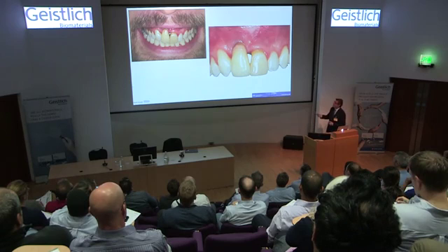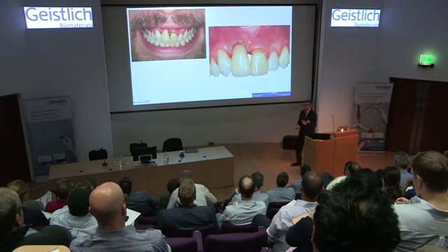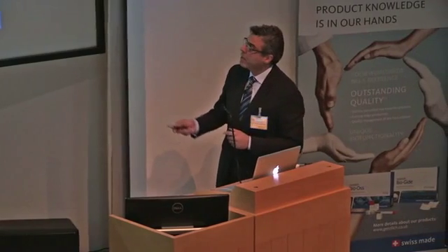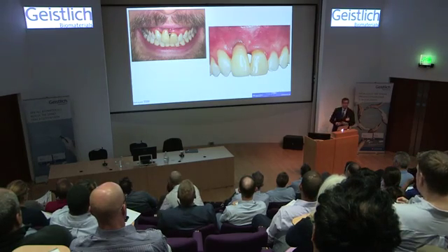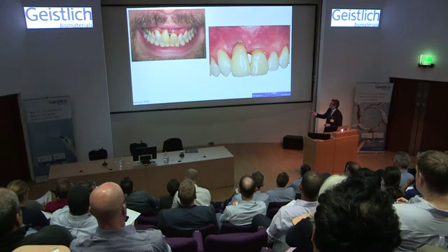Patient has had an iliac crest bone graft to augment this site, an iliac crest bone graft to augment a single incisor site. Right? Talk about overkill. And then the patient ends up with an implant in the upper right central incisor, and that, ladies and gentlemen, is the outcome. Right? And that is clearly an aesthetic disaster. So he was referred in to try and do something about this area here.